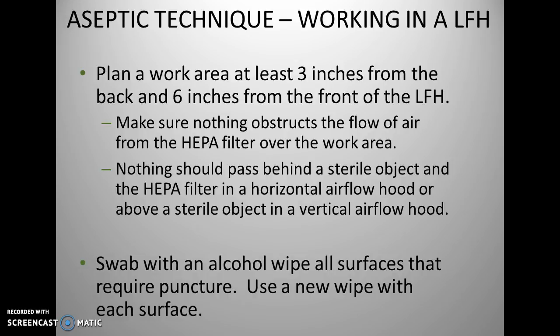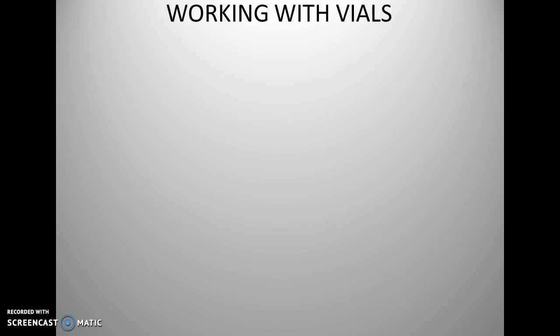Everything should be wiped with alcohol, especially anything that needs to be punctured. Use a new wipe for each surface. Once you wipe, you discard that particular wipe, and then you do it again with the next surface.